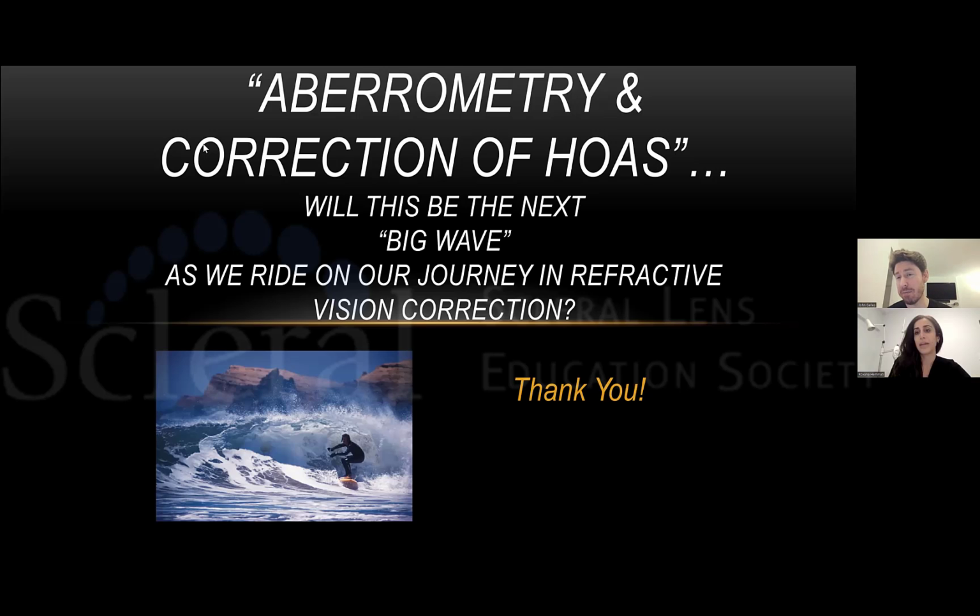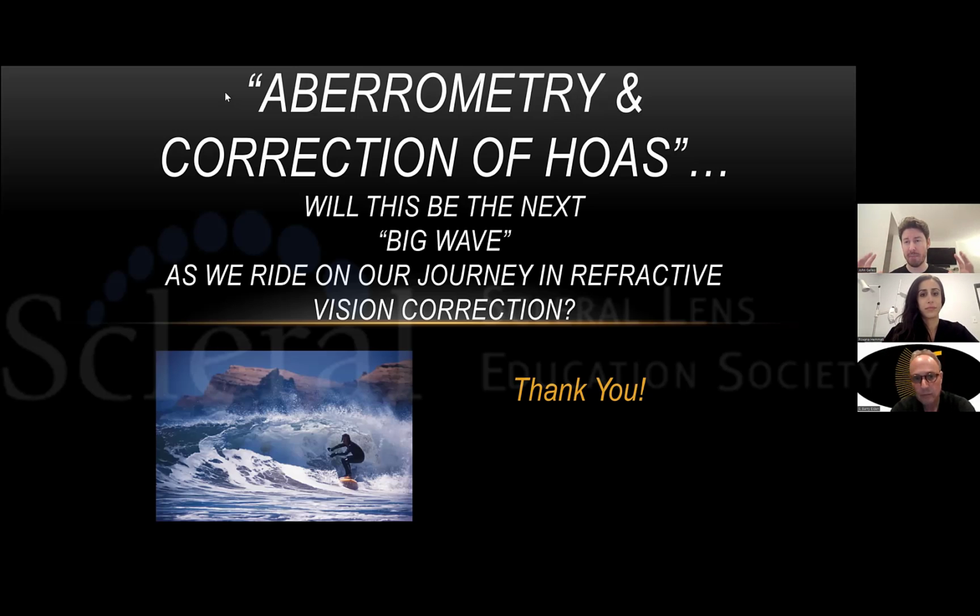It really depends on the technology that you have, right? Because if you only have the ability to map out a front surface, like if you're using a topographer that's integrated with an aberrometer, the challenge there is always going to be that you're only measuring the front surface of the cornea. If you're looking at the internal aberrations, some of those are coming from the posterior cornea. Really, the only way to do this is on some of the tomography devices, where it will actually divide out the surfaces for you.